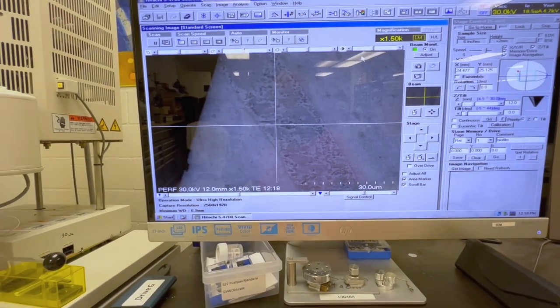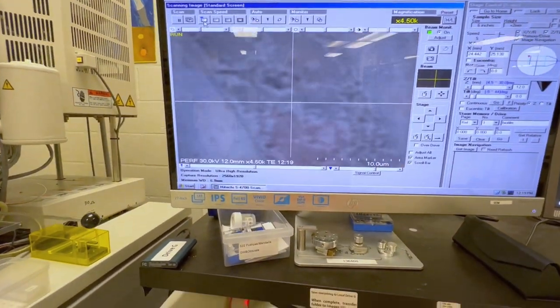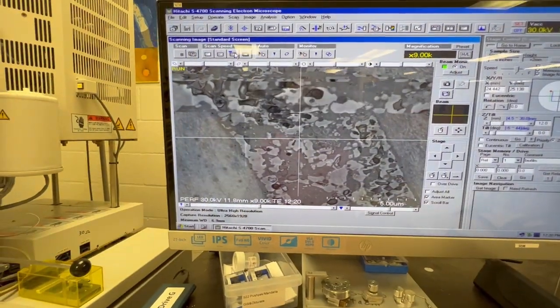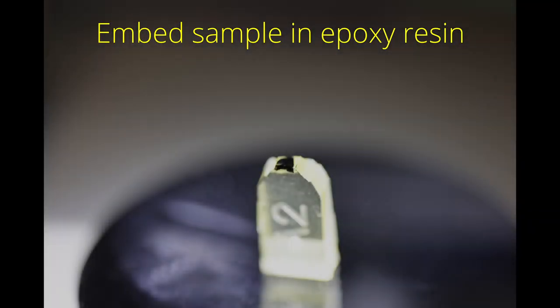So let's take a look at a complex procedure like creating specimens for TEM examination and see how well it holds up. In creating specimens for TEM examination, it's a relatively complex procedure. You have to embed the specimen, create a trapezoid, section 300 nanometer semi-thin sections, survey that, then create another trapezoid for 70 nanometer sections, and then you have to stain them and image them.